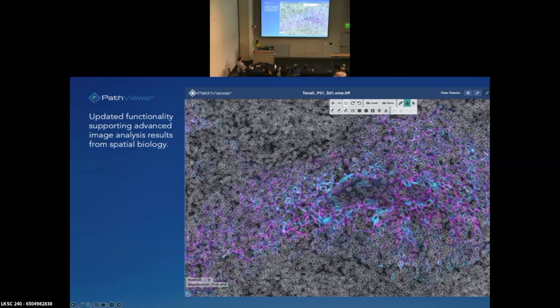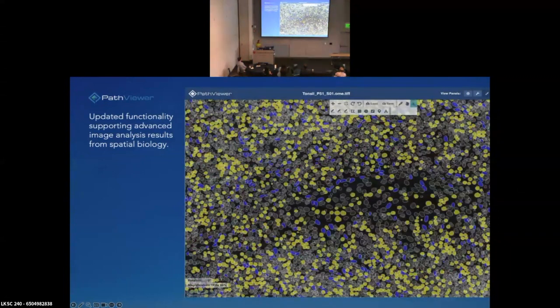In this particular image, we had about 1.5 million objects on this particular slide, and you're seeing those overlaid with the original image. And we have about 100 or so measurements that we've taken of each of those 1.5 million objects. And here, I'm just color coding the objects based on those measurements. In this case, we color coded it based on the circular compactness of the object. And so you have some nice round objects in yellow and some more elongated objects in blue. And then everything that didn't fall within the tails of that distribution is not colored in, not filled in.